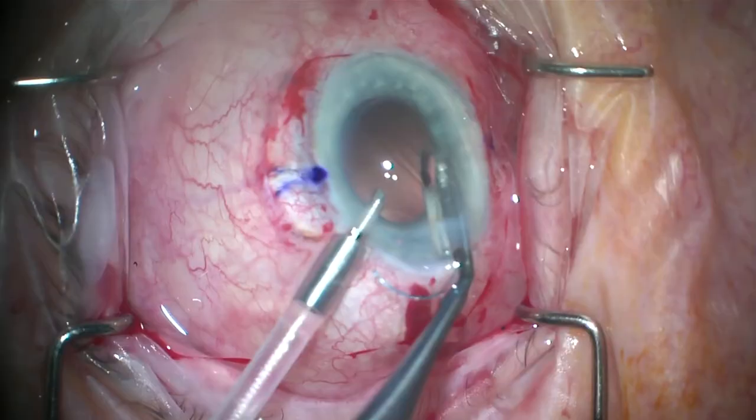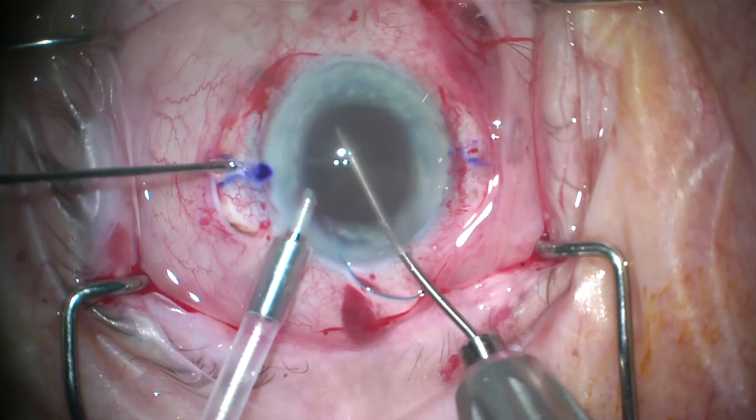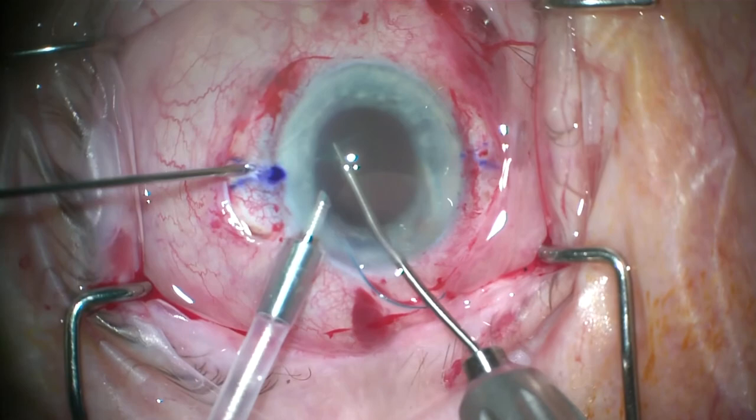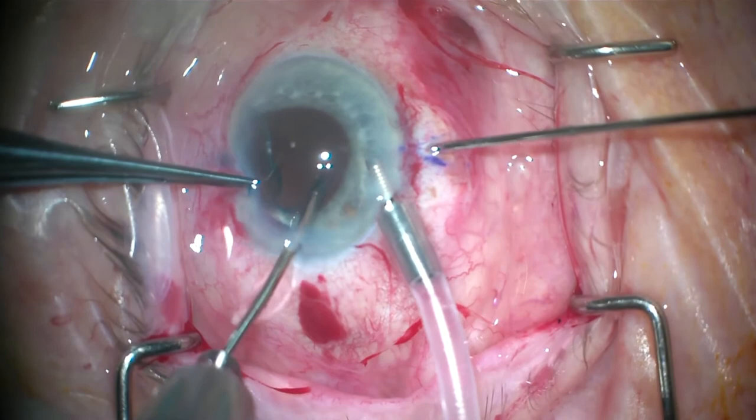A 3-piece intraocular lens is inserted. Forceps are passed through the sclerotomy wounds, and using a handshake technique, the tip of the haptic is grasped and slowly pulled out from the sclerotomy wounds, externalizing it. The same is repeated on the other side, bearing in mind the first haptic has to be grasped by an assistant.